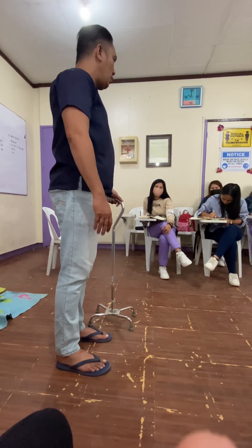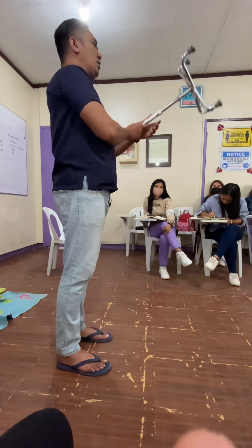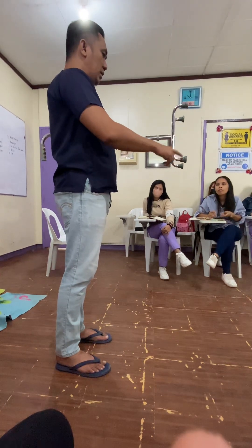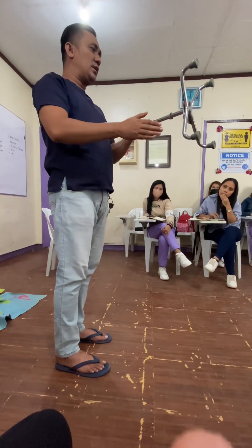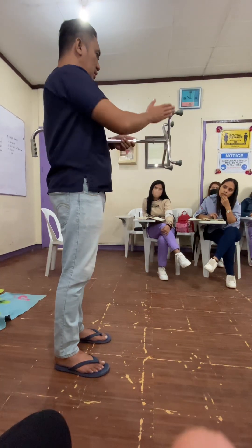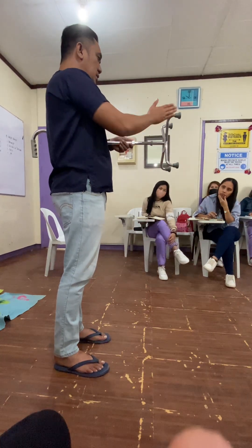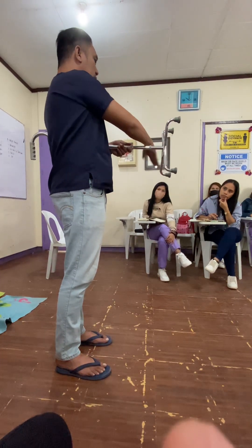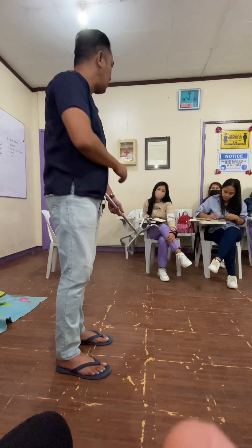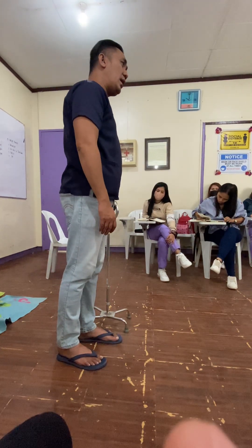Aside from that, you have to position the cane correctly by checking the legs or the tips of the cane. If you notice, it has a different shape — it looks like a quad cane. The base tips should be facing toward the patient or the leg side, and the outer tips should be facing outside. If it is on the left side, that is the correct positioning.